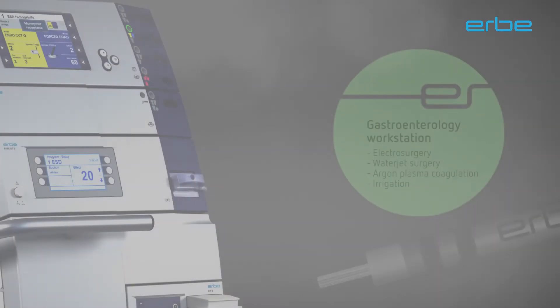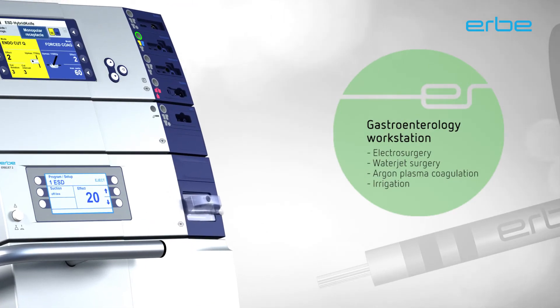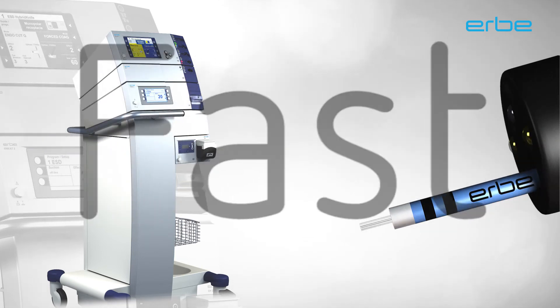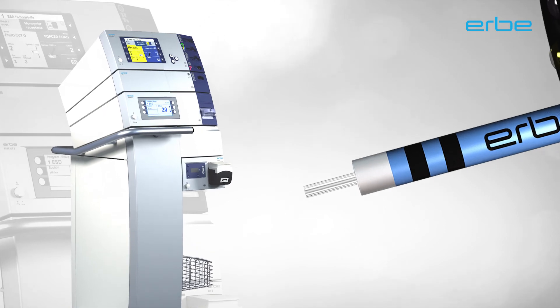Precision designed for the hybrid knife and tailored for its individual requirements, the Erbe VIO GI workstation supplies the instrument with power. Safe, simple, fast. The HybridKnife from Erbe stands for a new dimension in ESD.